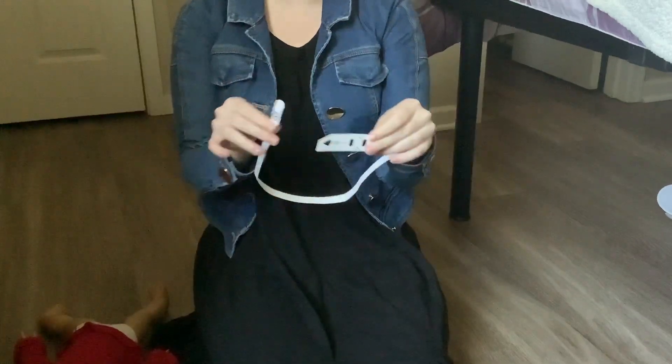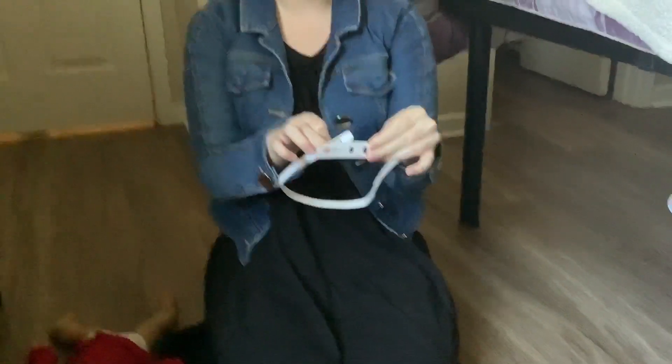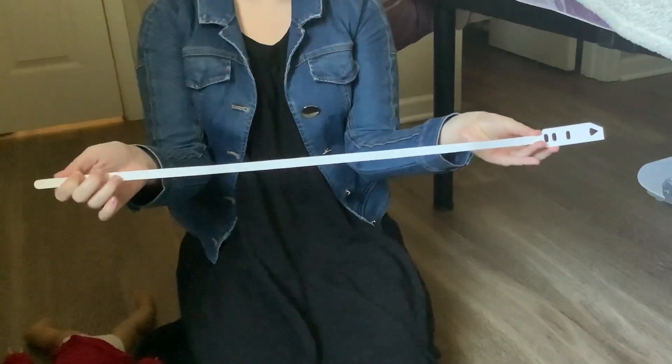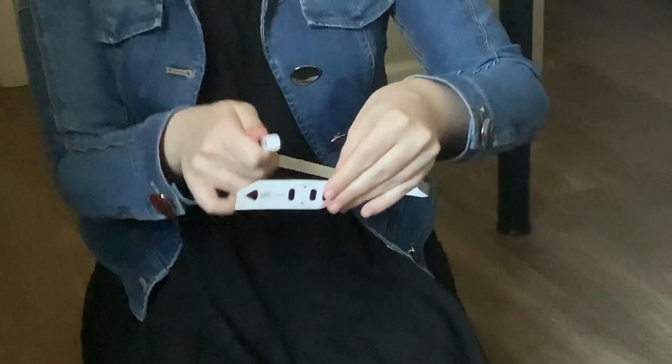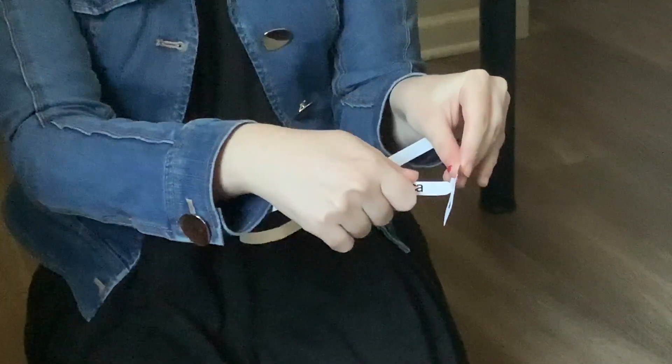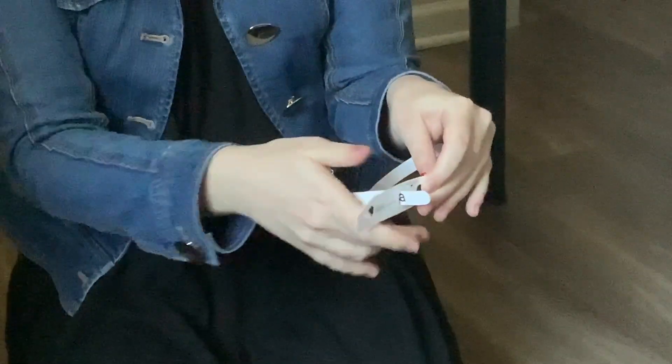To set this up, what you want to first do is skip this triangular cutout and go to the first oval orbital cutout. From the back — the side where there are no numbers along the tape — you're going to want to stick the slim end of the tape through and pull it slightly.